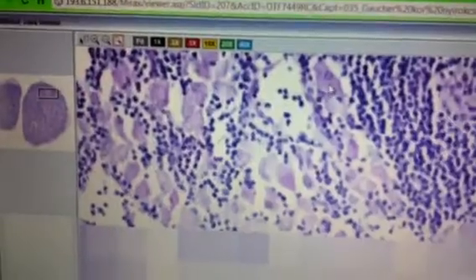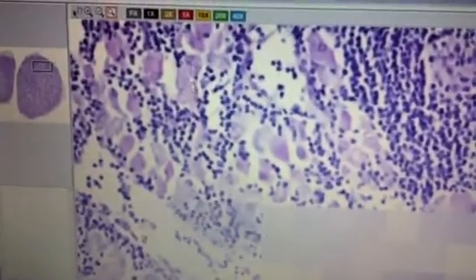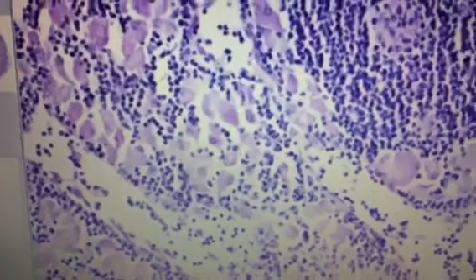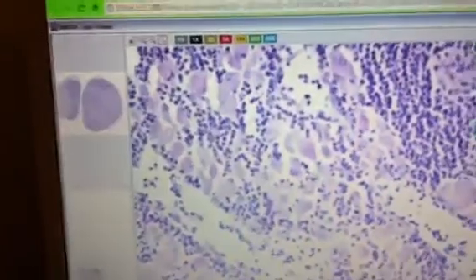It's not marked in the book or anything, so I don't want to take a chance, but if somebody forced me, I would say maybe these here. This, and this, and this would be the Gaucher cells with the positive staining. Okay.